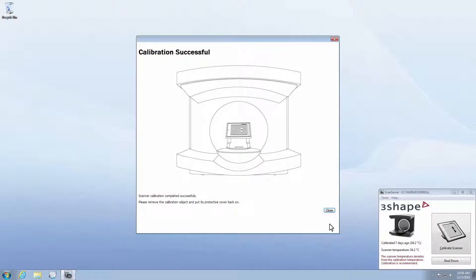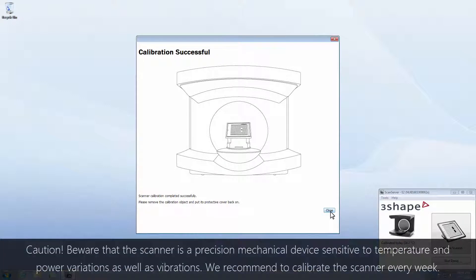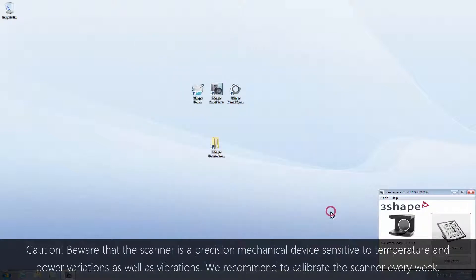After the calibration is done, click the Close button. You can now remove the calibration object from the scanner. Put it in the protective cover and place it in a safe space.